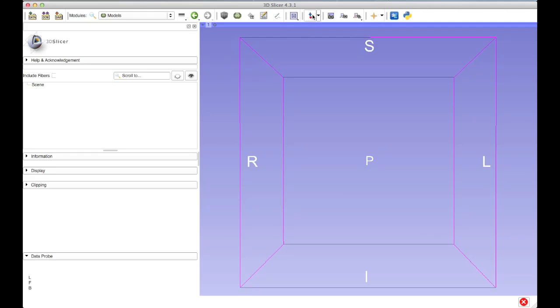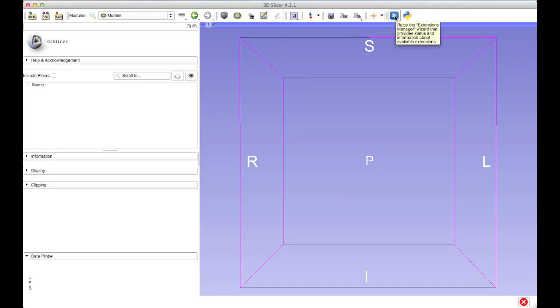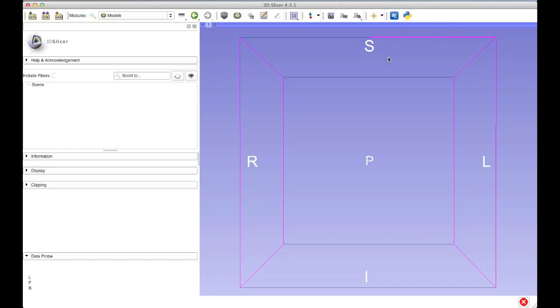Then we have some mouse options, a couple of different scene views, and crosshairs. So for instance, if you need to see a very specific part of your data on all three slices at once, you can use that. The extensions manager is how you customize your Slicer experience — you can load additional modules or wizards using this tool. And lastly, we have the Python Interactor icon, which allows us to launch the Python console of Slicer. So that's just a quick orientation of the Slicer interface itself.